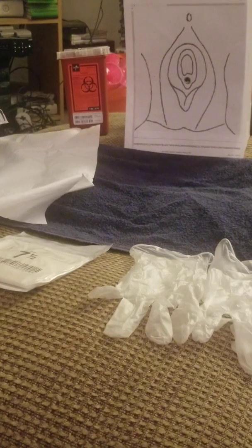Now, before I start the actual catheterization procedure, I will do hand hygiene again. Put on some clean gloves, and I'll clean her perineal area with whatever I have present, whether it's my washcloth or my skin cleanser, something to definitely clean her. And I will wipe from above the orifice downward toward the sacrum, from front to back, rinse, dry, remove gloves, and then I will be performing my hand hygiene again.